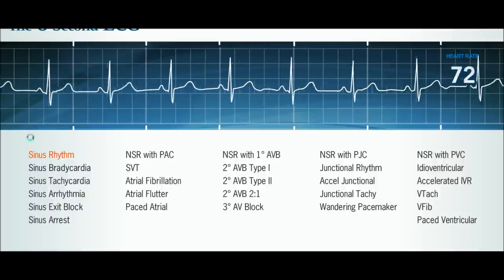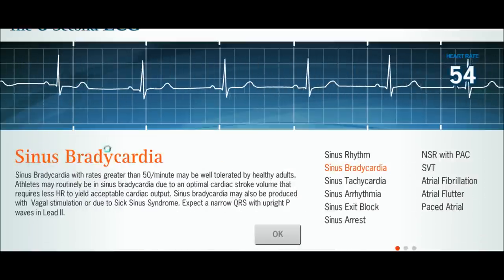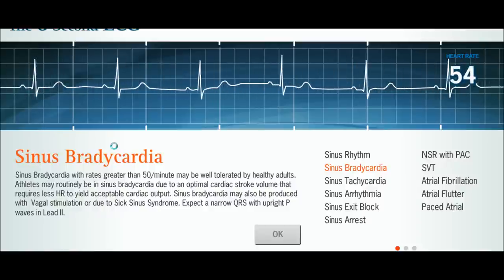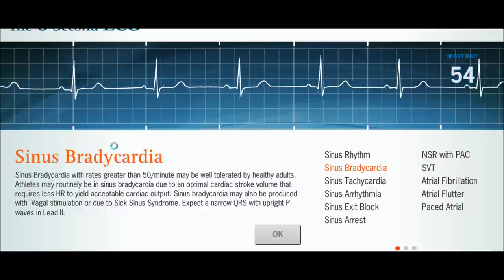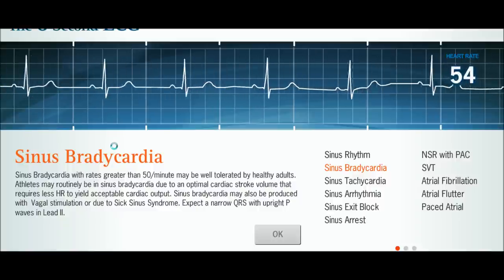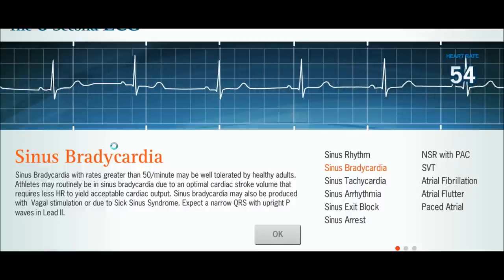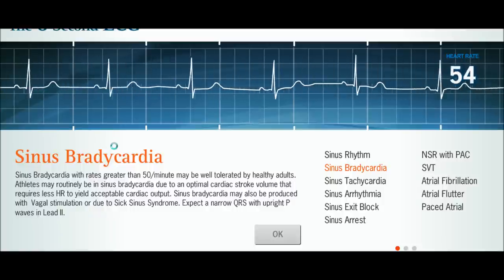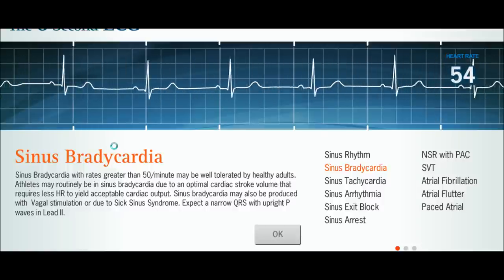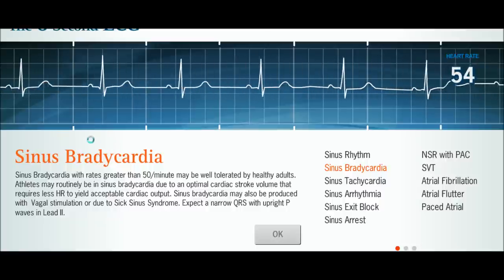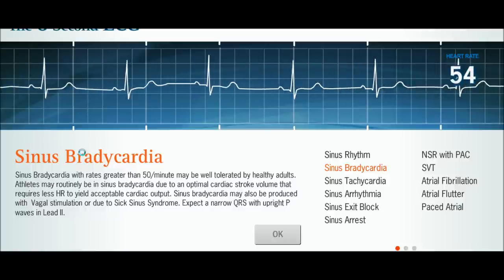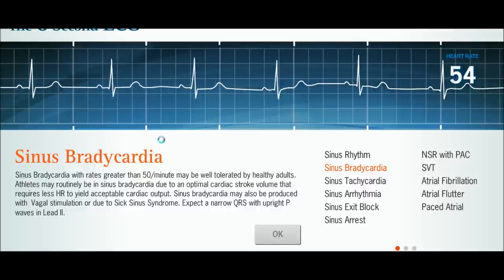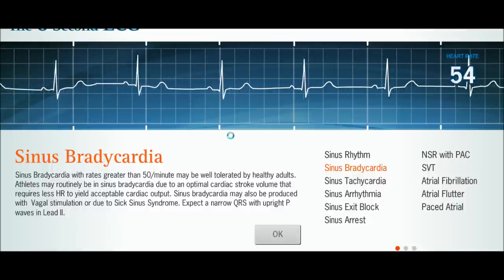We'll start with the first pathologic rhythm — sinus bradycardia. This is essentially when your heart rate is a normal sinus rhythm but at a rate less than 50 beats per minute. It isn't necessarily pathological; it can be normal in athletes or people with a naturally low resting heart rate. It's only pathological when it causes symptoms such as lightheadedness or passing out. You can also have sinus bradycardia caused by intense vagal stimulation, such as a vagal rub on the carotid sinus, but it's typically non-pathological.